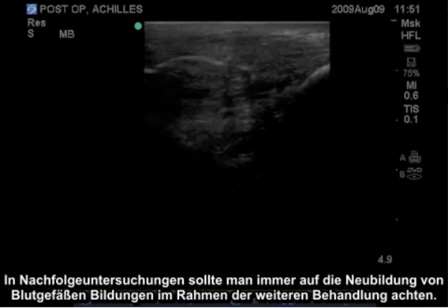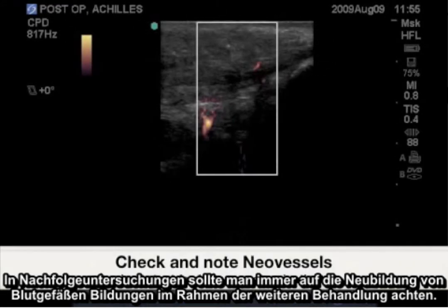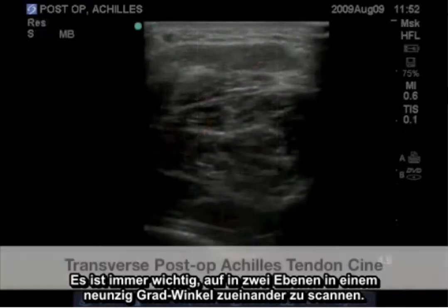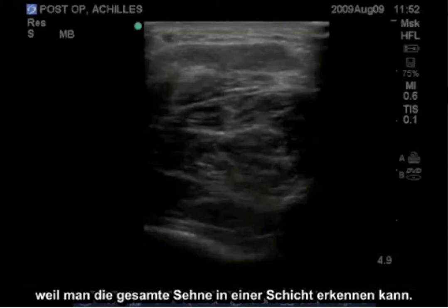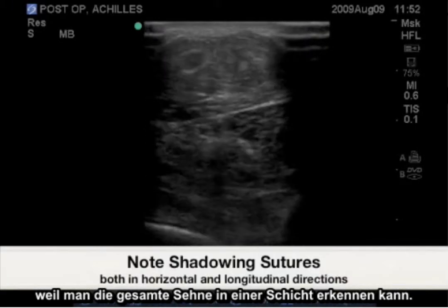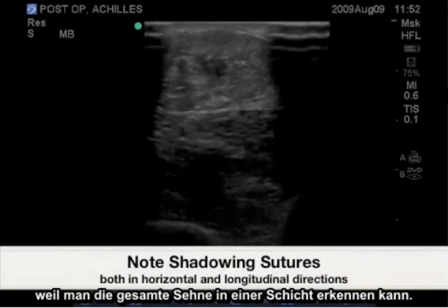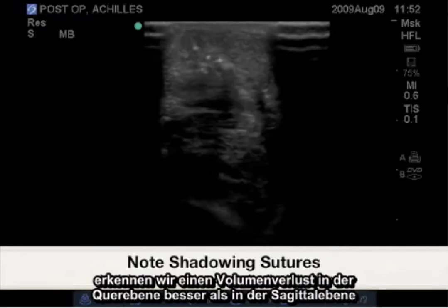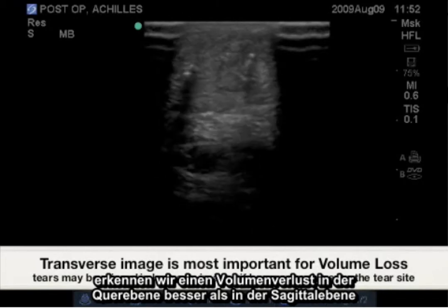In follow-up examinations, always check for neovessel formations as therapy continues. Scanning in two planes 90 degrees from each other is always important. The transverse plane is more important due to the ability to view the entire tendon in one slice. As you scan up and down the tendon, we will see any volume loss in the transverse plane better than in the sagittal plane.